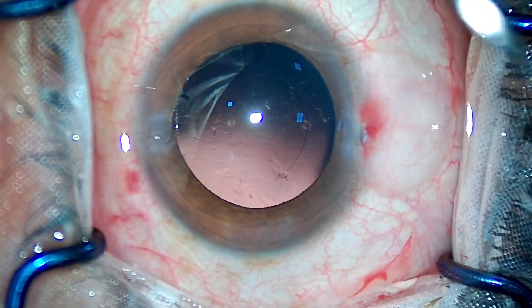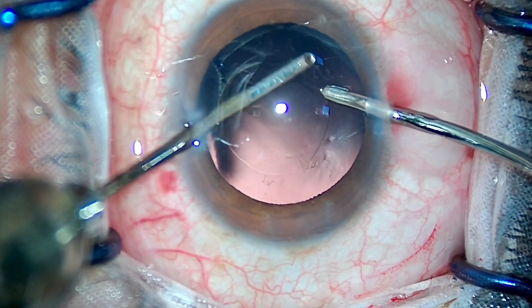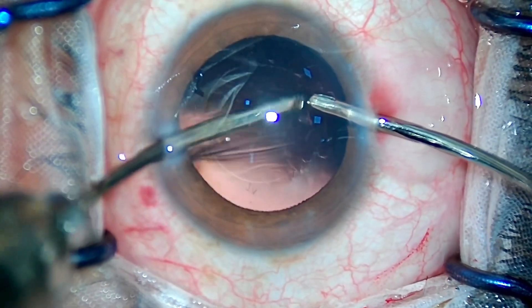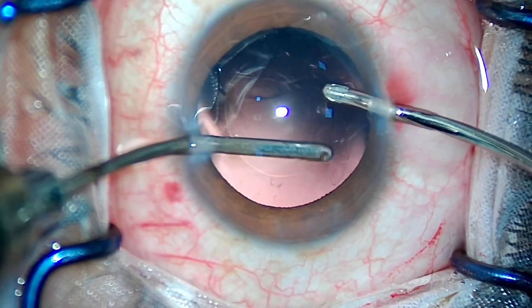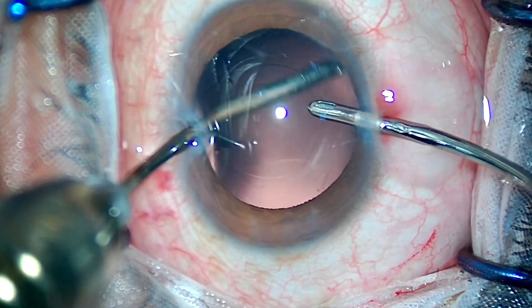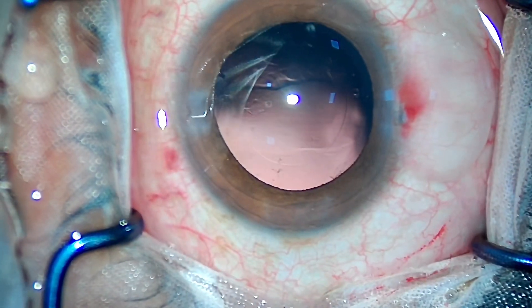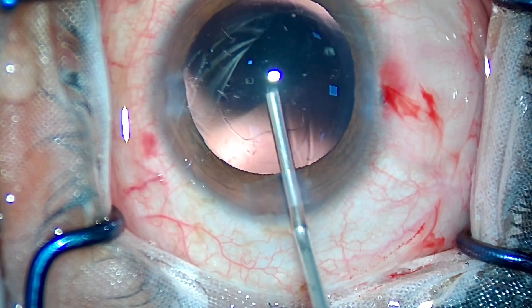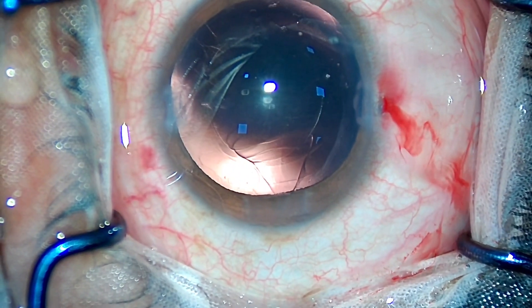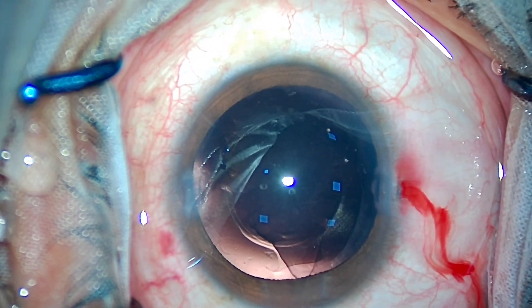Coming to the right-hand side — if you look closely right here, you can even see the cortical cells being aspirated and the clearing of the anterior capsule. This is a little difficult maneuver for beginners, but it's very important to remember this step, especially for all your VVIP patients who don't want complications related to YAG capsulotomy. When you are a surgeon, you should strive to become a brilliant surgeon, not a mediocre one.